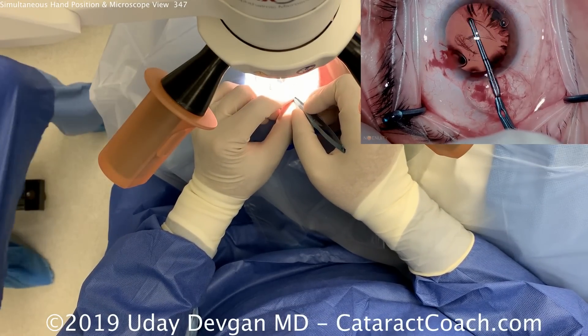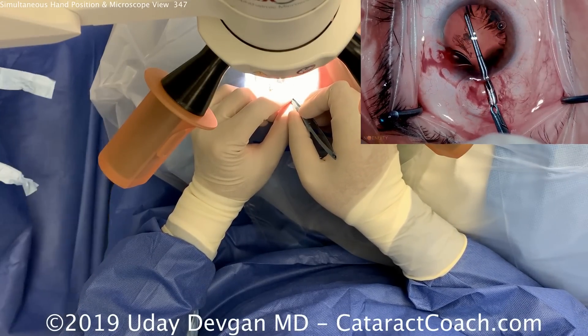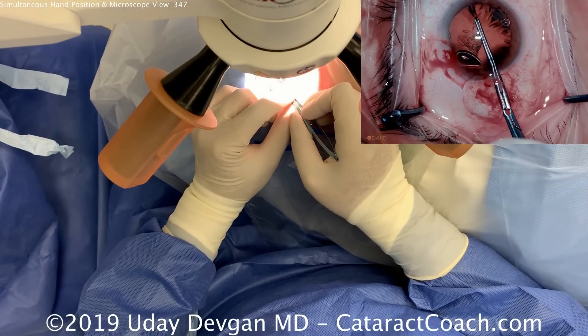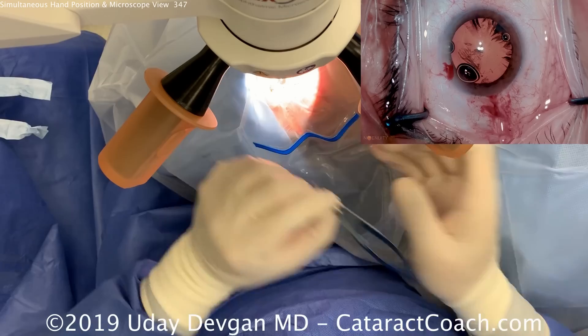In some cases I may use the left hand to help fixate the eye. If the patient wanders too much, I can use the chopper through the side port to accomplish that. But in this case the patient's doing a great job. Notice how we pivot in the incision.